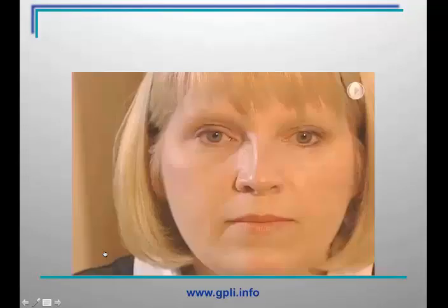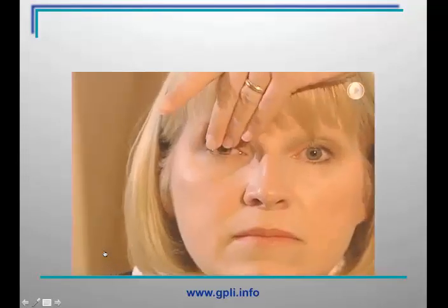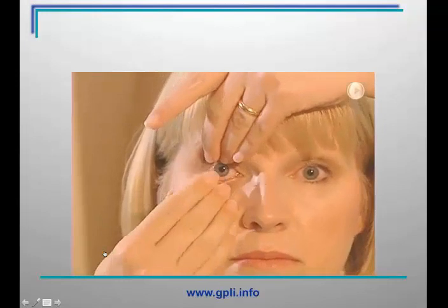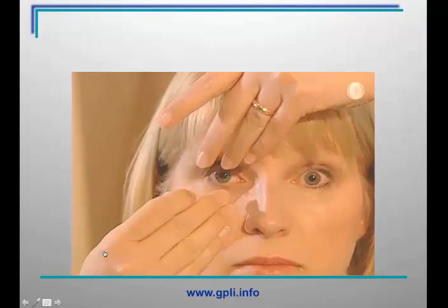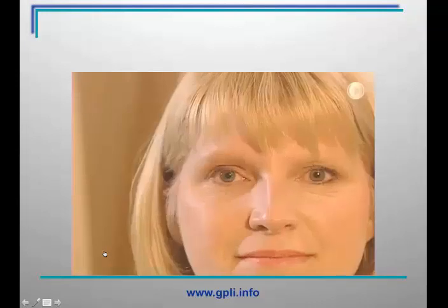Then there's the issue also of the proper insertion and removal of these lenses, and this does become important because we're in a situation where these lenses typically have lower edge clearance, they're larger diameter, so the application and removal are very critical, as you'll see here. If you're going to insert, it has to be good lid retraction. You see that left hand coming over and getting the upper lid, and then the middle finger over the lower lashes, and that lens goes in very easily.